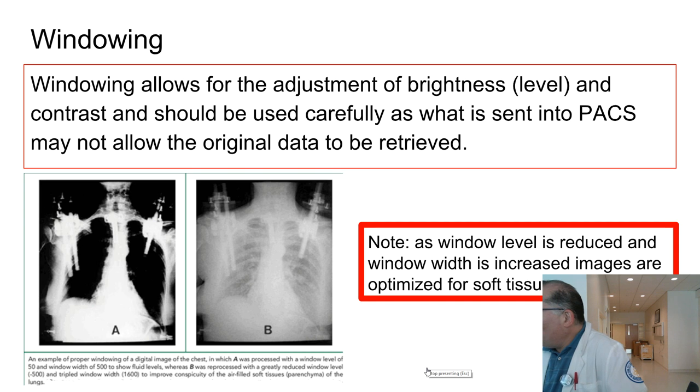And think about this too. We don't have this here, and hopefully I don't jinx myself, but if the ceiling tile comes down with a flood of water and destroys everything in that system, well, could you imagine if that happened in real life and you lost thousands of people's data? Not too good. Right. So there's redundancy built into all of these systems in that there's a backup that almost takes up as much memory as the original. There's some compression involved. So you save maybe a little bit of memory.